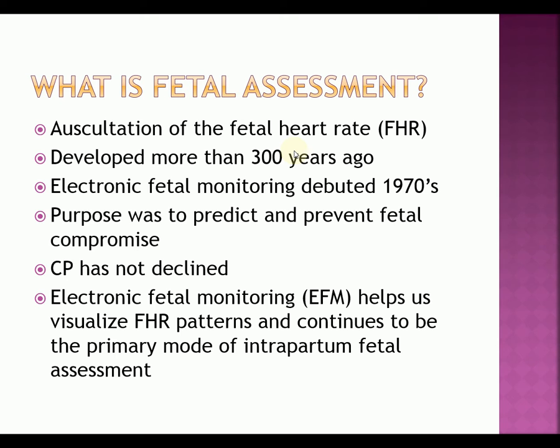They do that because the sound of the heart rate will reverberate from the bone in the forehead much better, and you'll be able to hear it better.